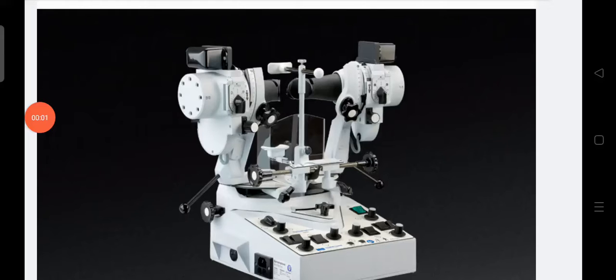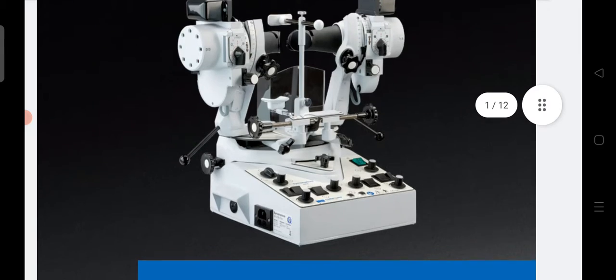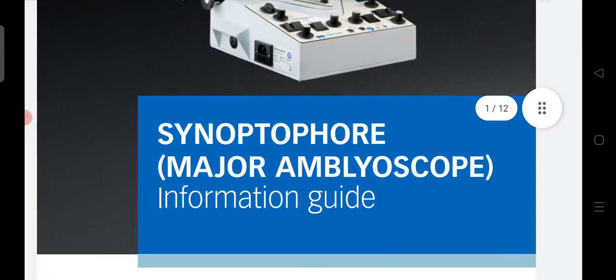Hello, today I will be discussing the major operations of an amblyoscope or a synaptophore.